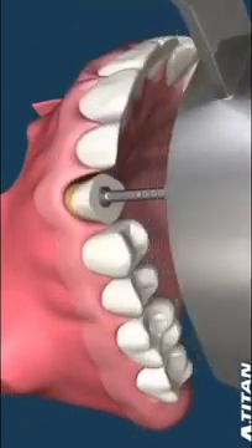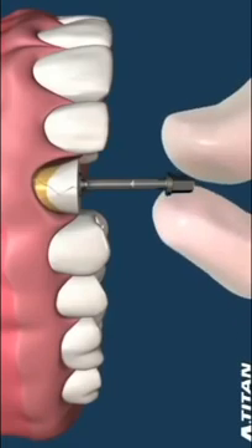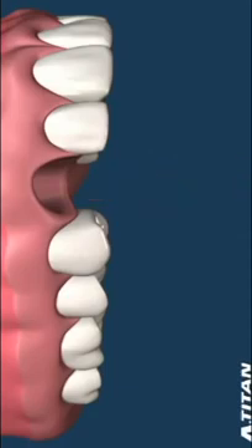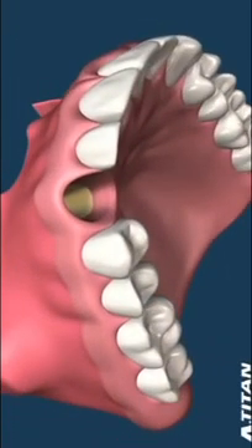Now the extraction tool and the tray are removed. The tooth, which is loose in the socket, can be easily removed with light finger pressure. This is a very atraumatic way of removing a tooth without damaging the soft tissue or bone around a broken tooth.